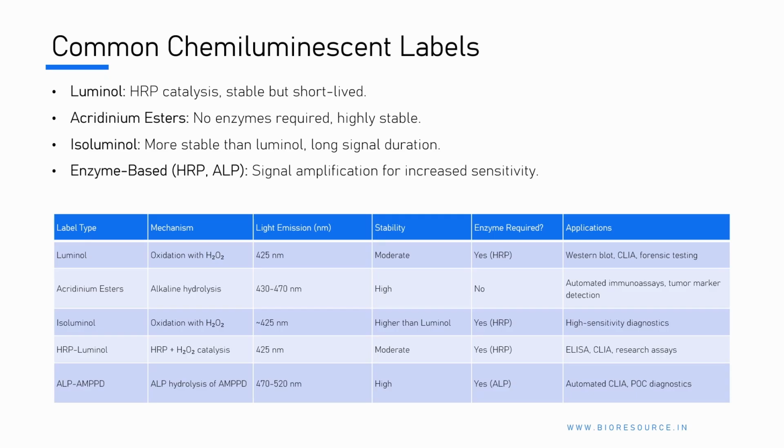The advantage is that it is well established in ELISA and CLIA platforms, and enhancers can boost the signal intensity. The disadvantage is that it can suffer from enzyme degradation over time. So stability is one of the concerns.